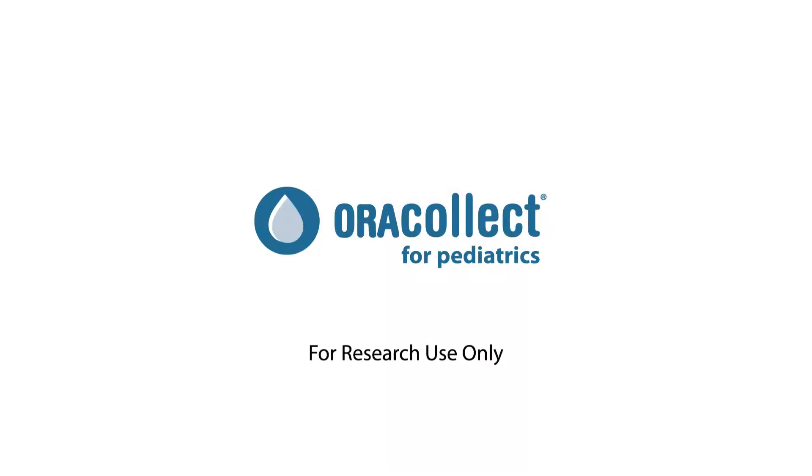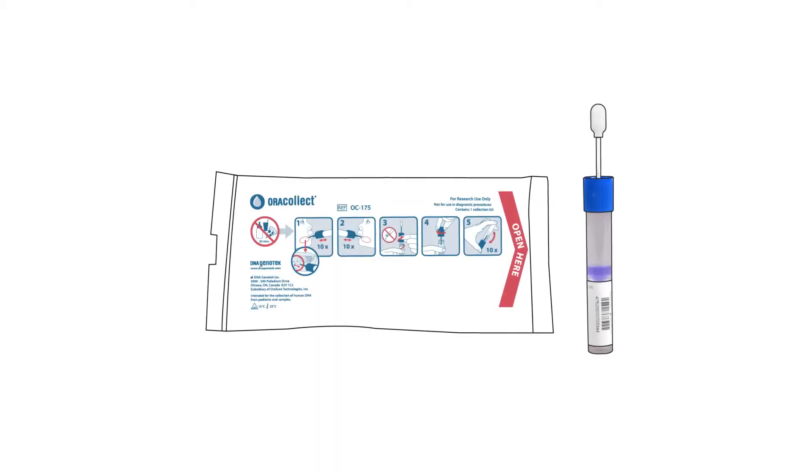AuraCollect for Pediatrics is designed for the collection and stabilization of DNA from pediatric donors. Each AuraCollect for Pediatrics package contains one collection kit for single use.